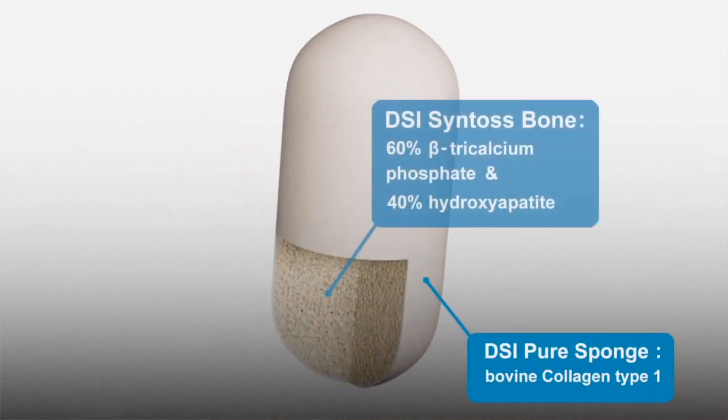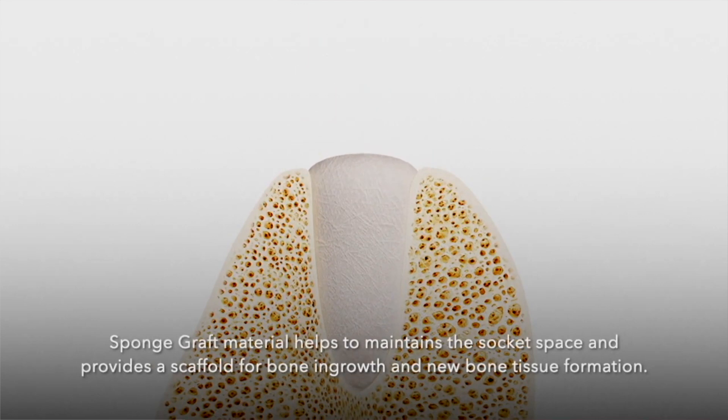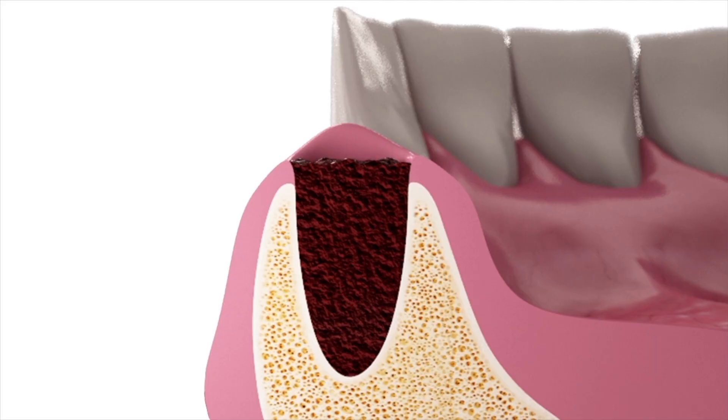The bovine Achilles tendon collagen carries the bone graft for easy and efficient delivery to the site, eliminating the hassle and time spent mixing and packing particulate bone graft, while also eliminating the potential for graft washout. The type one collagen acts as a wound dressing not only to stabilize the clot but also to absorb and deliver blood flow to the slowly resorbing graft — a feature critical to the initiation of bone formation.